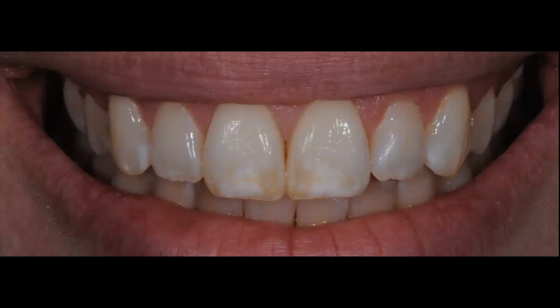This particular case, this was done with one of my dental students, Dr. Dean, who is an endodontist today. This was when he was, I think, in his second or third year of dental school. So we have this patient with dental fluorosis. Again, the first thing that we're going to do, we know that we've already decided.